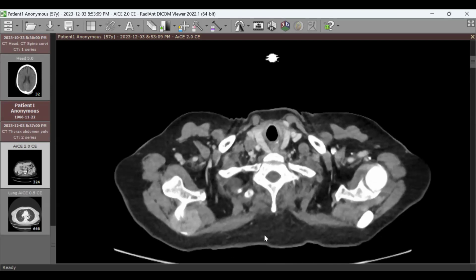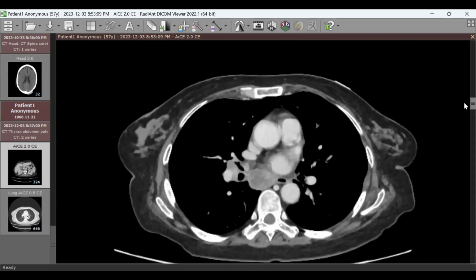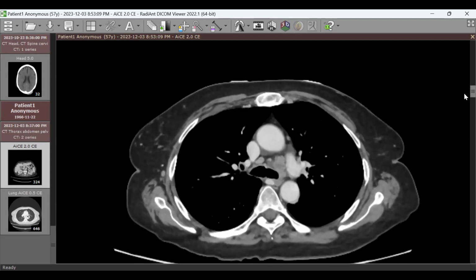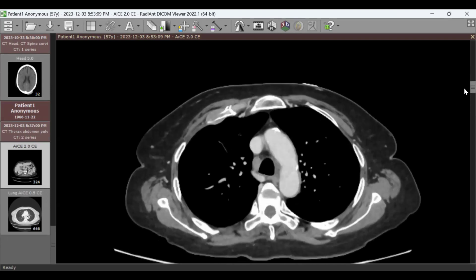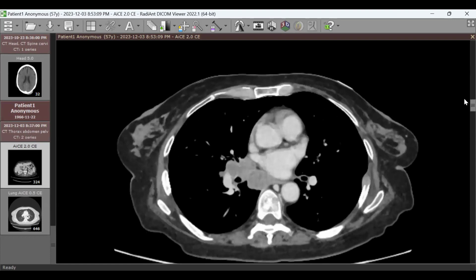We can take from lymph nodes. We can have a neck ultrasound, by ultrasound-guided lymph node biopsy. And then we have a big lesion here. Yes, it can also be accessible and done under ultrasound. Okay, let's go into the thorax. In the thorax we can do it by endobronchial endoscopy. Exactly. We can take from the lymph nodes, also from the main mass.